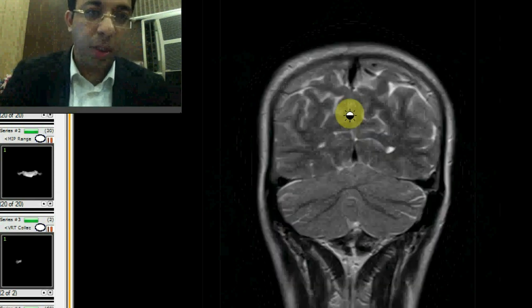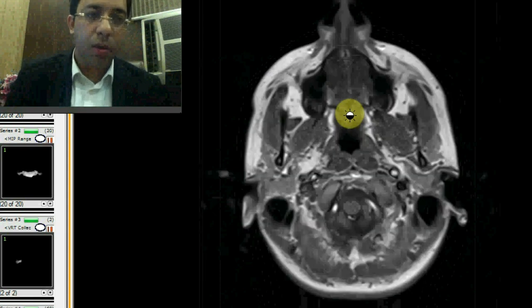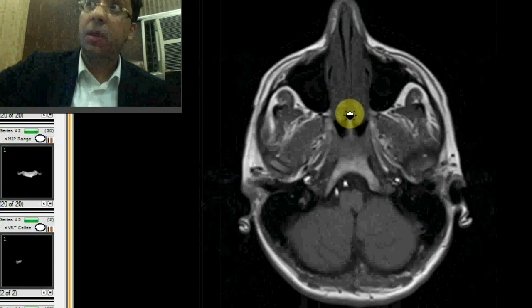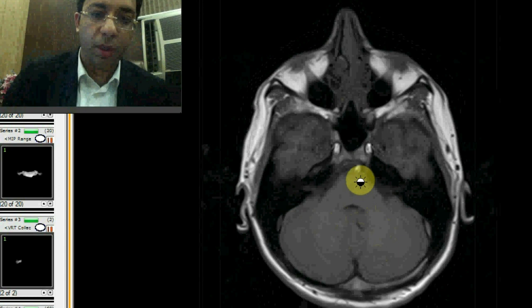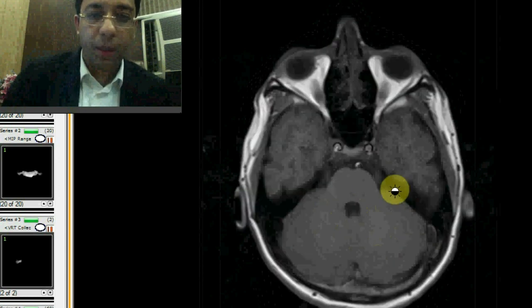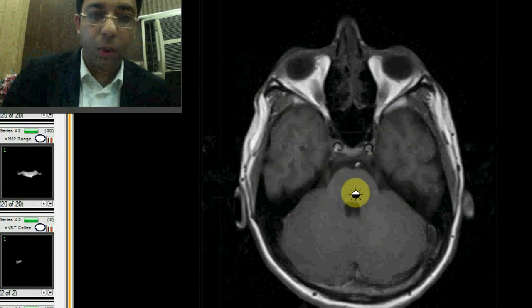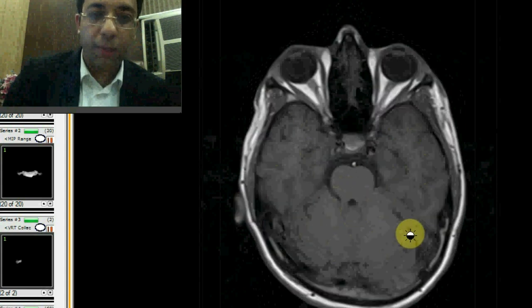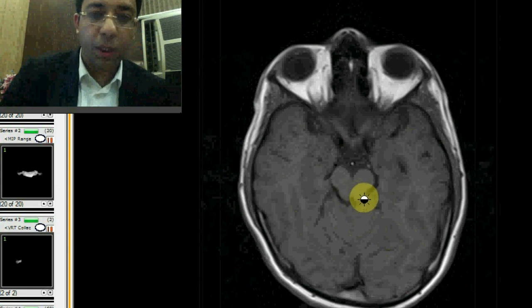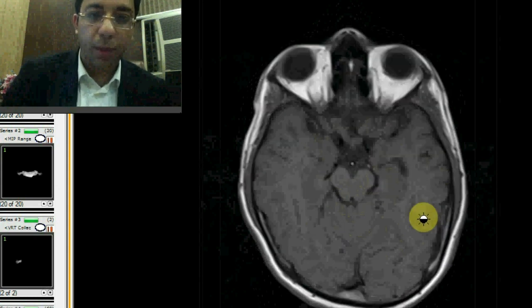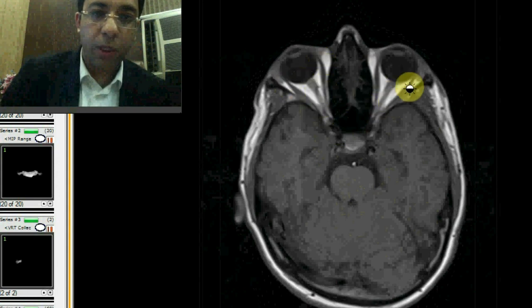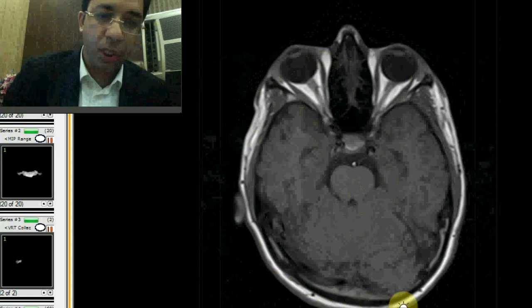We also do a T1 weighted image. On T1, you can see the medulla, vertebral arteries, cerebellum, fourth ventricle, basilar artery, seventh and eighth nerve complex, fifth nerve, temporal lobe, pons, middle cerebellar peduncle, aqueduct, tectal plate, optic chiasm, uncus, optic nerve, medial rectus, and lateral rectus. Fat appears white on both T1 and T2 weighted images — you can see the fatty layer as a bright area on T1.